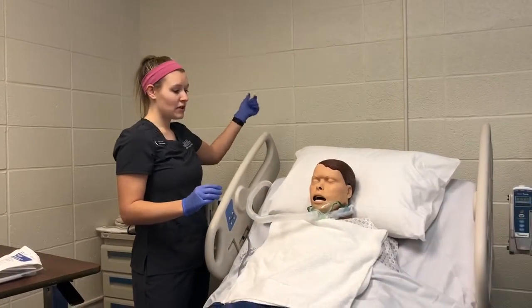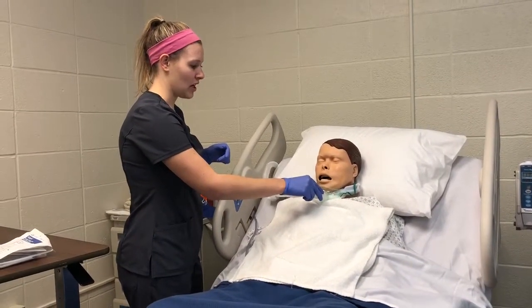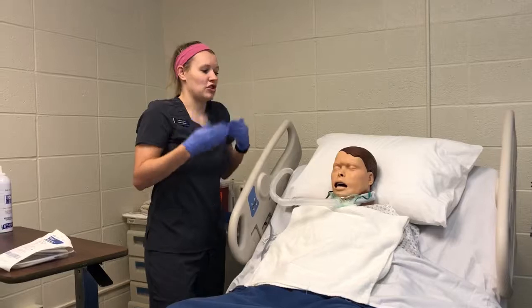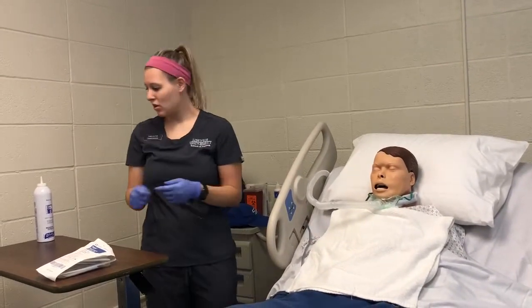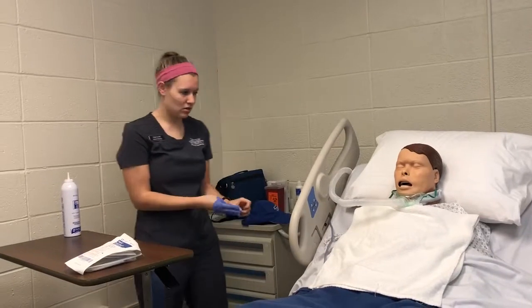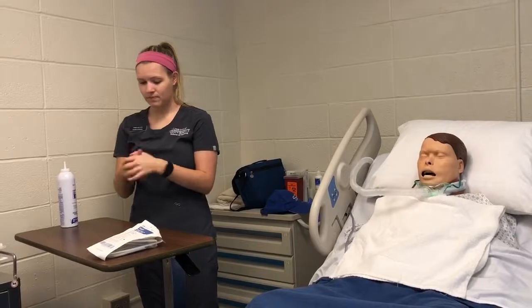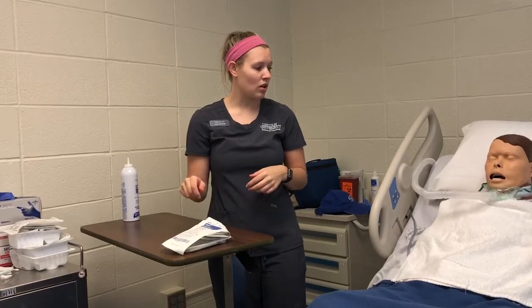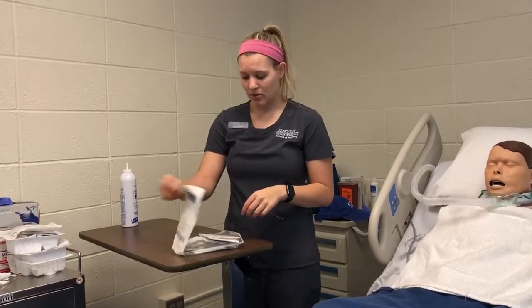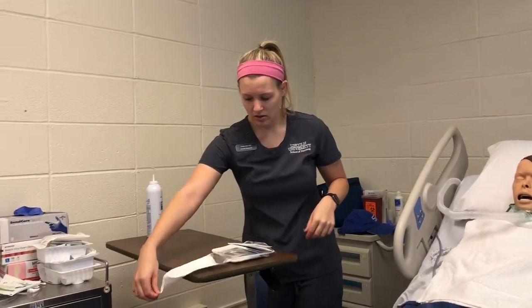So I've made sure to turn my oxygen all the way up, so my patient is getting hyperoxygenation right now, so that they have a little bit more in their system before I take their oxygen off to suction them. So I'm going to take off these gloves, wash my hands, and I have my suction kit catheter ready. So I'm just going to open that away from me.